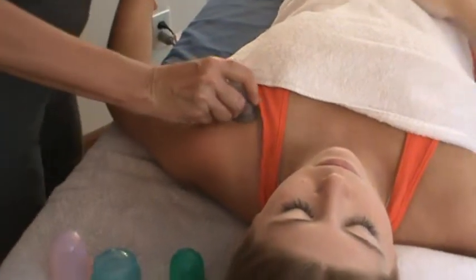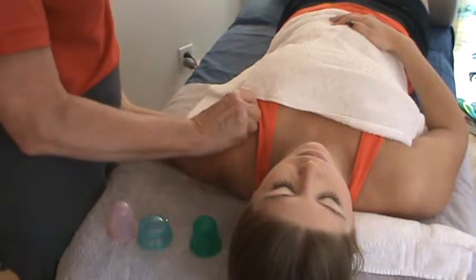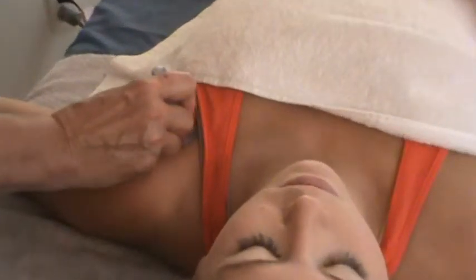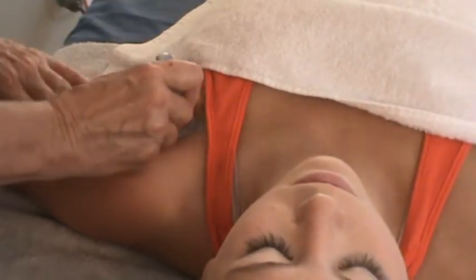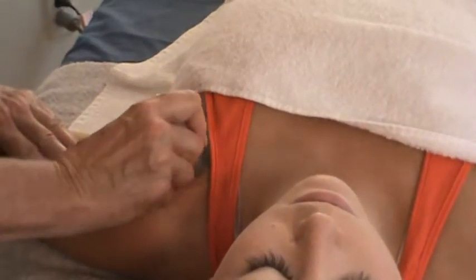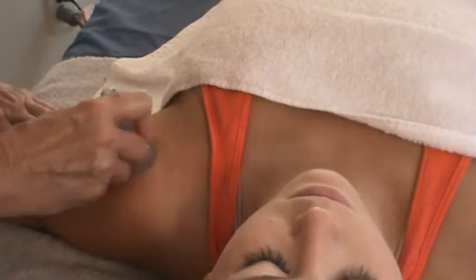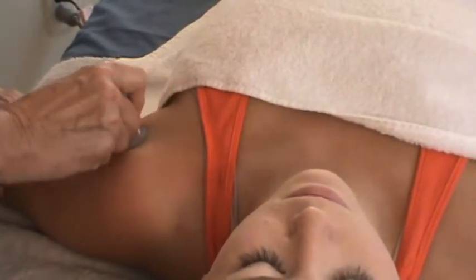Working around anterior deltoid into the pecs. Now, depending upon the person you have, when you're working with females, I'll keep a nice drape over the breast tissue, but I do want to go over the upper chest because of that pec tension. So being non-invasive to the ladies, having a nice drape.